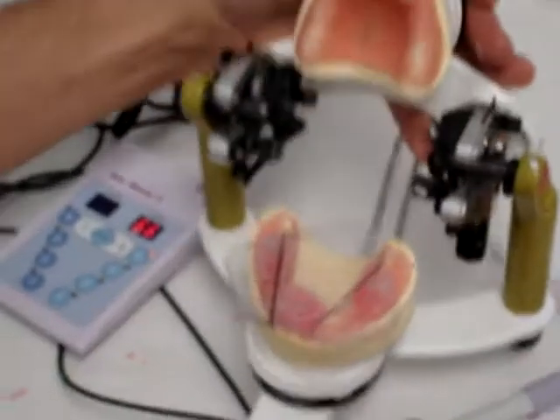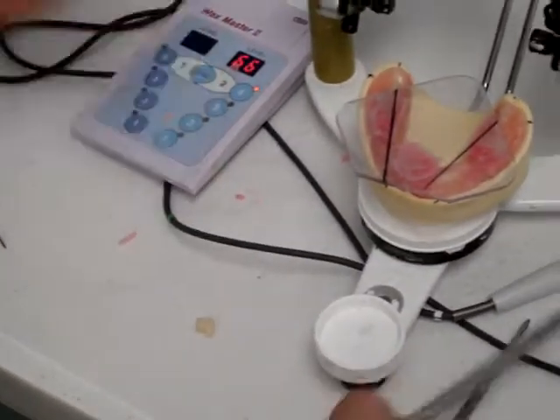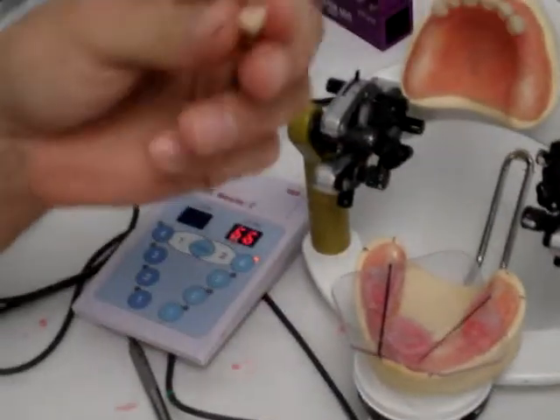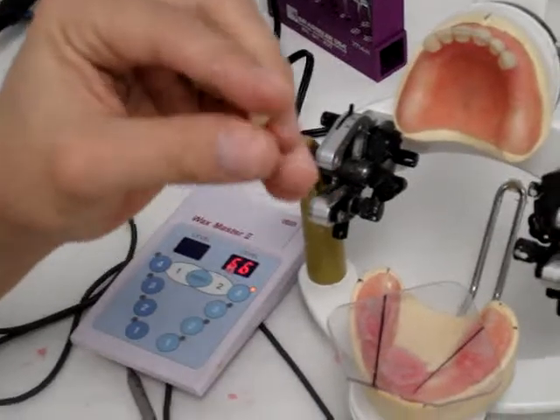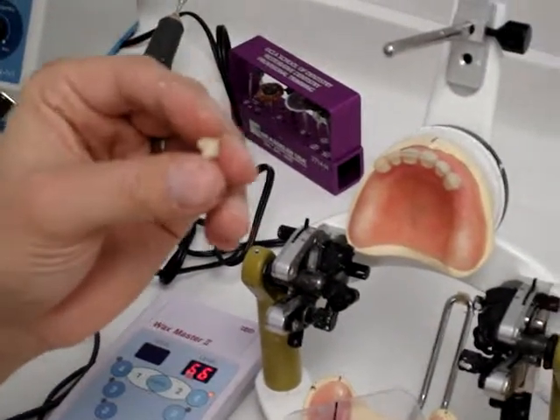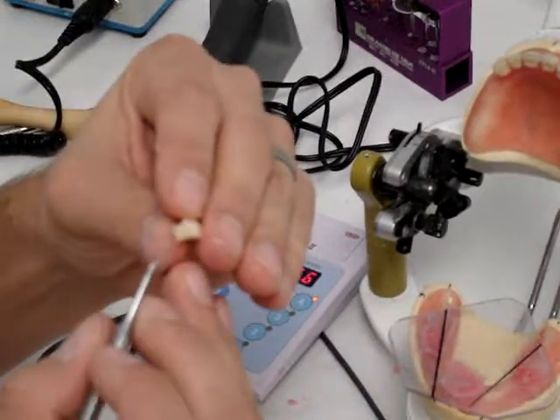The next thing we're going to do is move on to the premolars. When you first buy these denture teeth and take them off the rack, they're extremely confusing trying to differentiate between first premolar and second premolar, and mandibular versus maxillary.